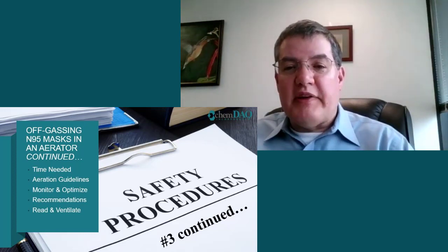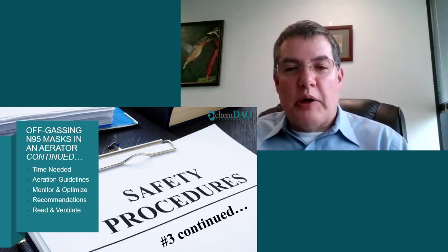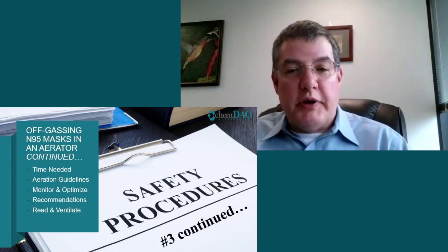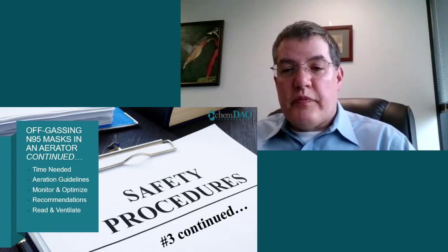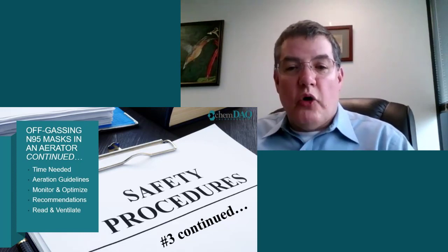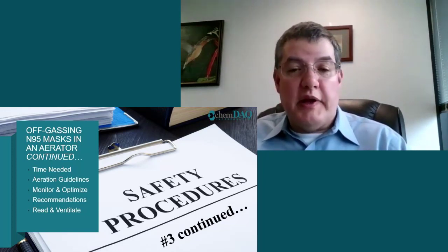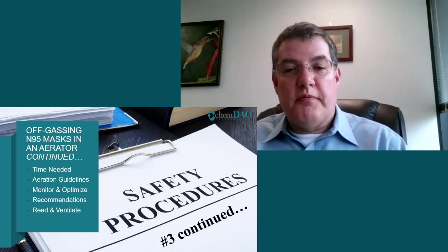We recommend placing a sensor directly over the sterilizer door, and at the end of the cycle, the operator will open the door and step back and watch the monitor reading. Once the monitor indicates that the hydrogen peroxide has dispersed, the operator will then unload the sterilizer. A monitor will provide protection from small leaks from the sterilizer in normal use, and protection from the unexpected leaks due to malfunction, wear and tear, and human error. So yes, it is recommended that hospitals monitor for hydrogen peroxide.